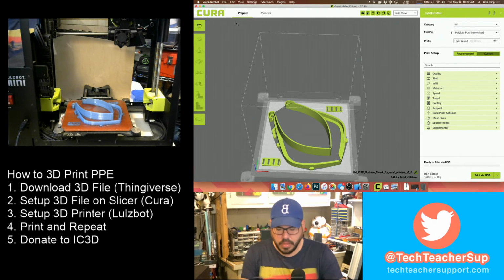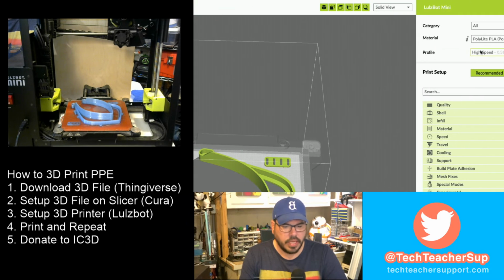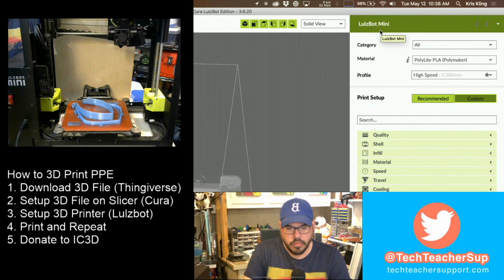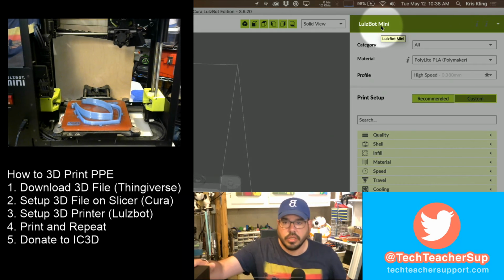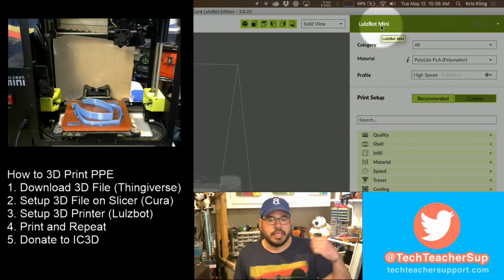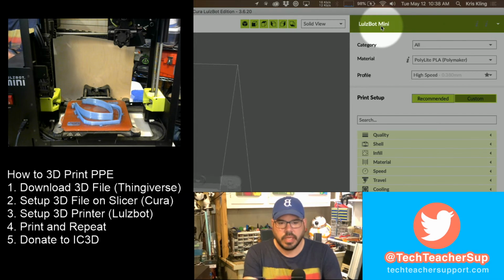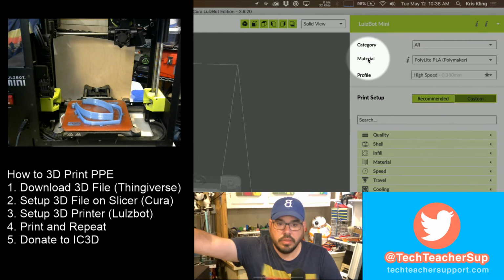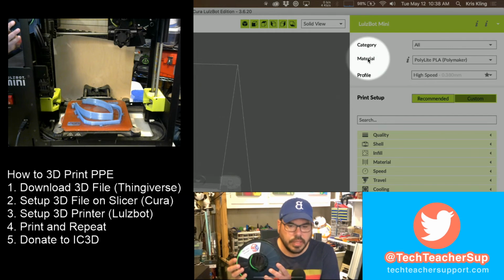We're already here. I'm going to zoom in a little bit and head over here just to highlight a few things. Number 1, you can see up here, we are running the Lulzbot Mini. So you want to make sure you tell Cura which printer you're running. If you're running a Lulzbot Taz or a Mini 2, whatever version it may be, you want to make sure that you are running your correct printer. Now to material, you want to tell it what material is in the 3D printer. Again, we're using PLA.